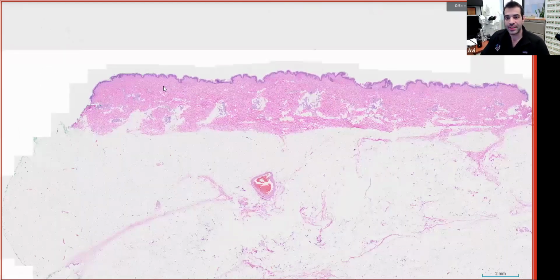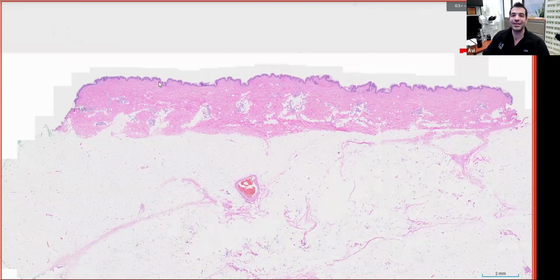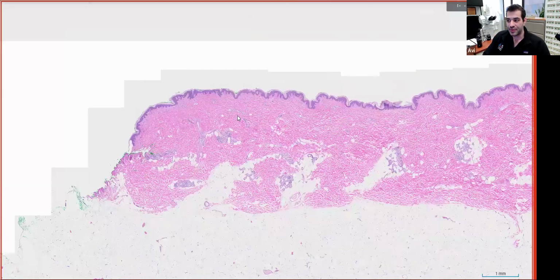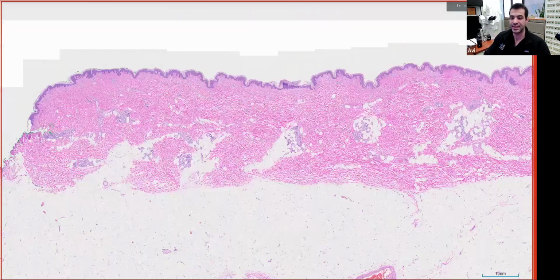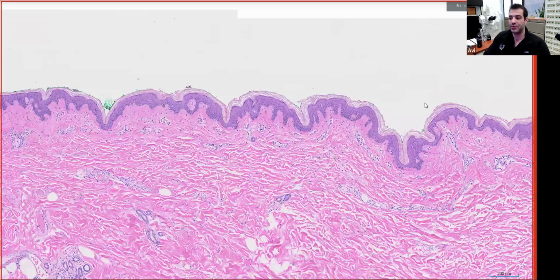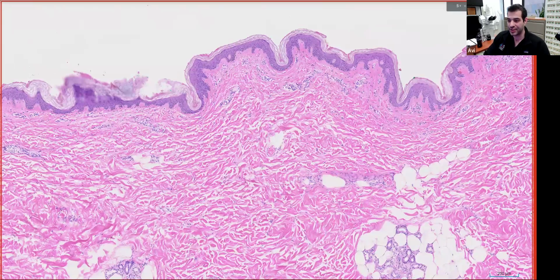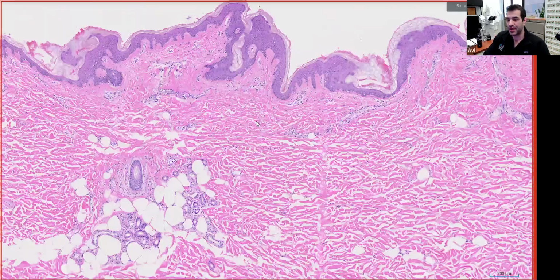So one thing we're going to discuss today to make one's practice more efficient is clickless panning. One thing I see very commonly in terms of how people approach digital dermatopathology is they do this sort of thing right here, where they look at a specimen, they'll zoom in so they can see at the appropriate magnification, and then they'll do this movement right here. They'll click, they'll drag to move, click, drag, drag. This is a very inefficient and time-consuming process.